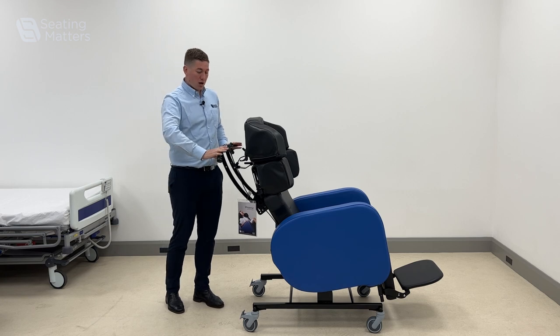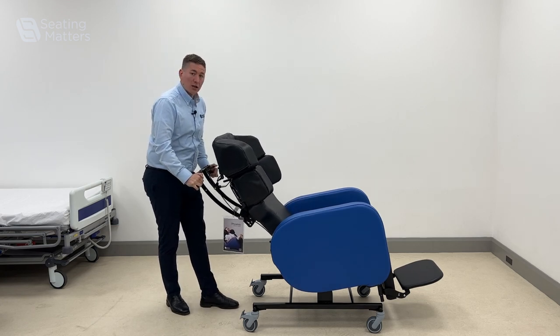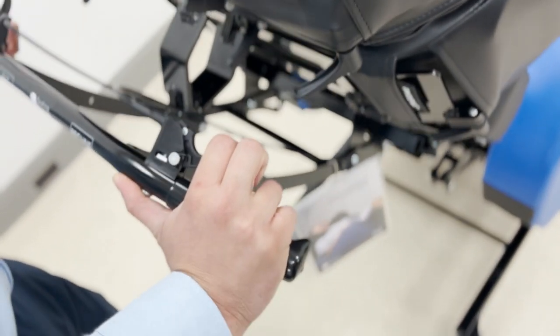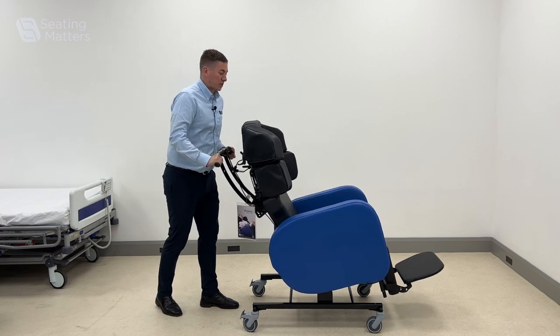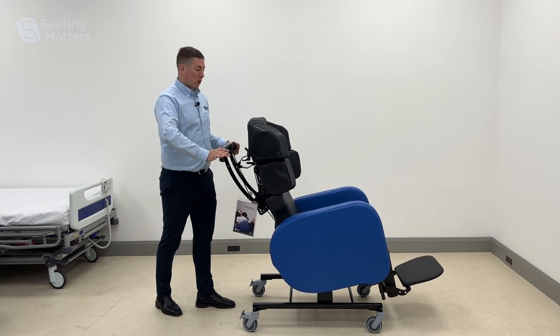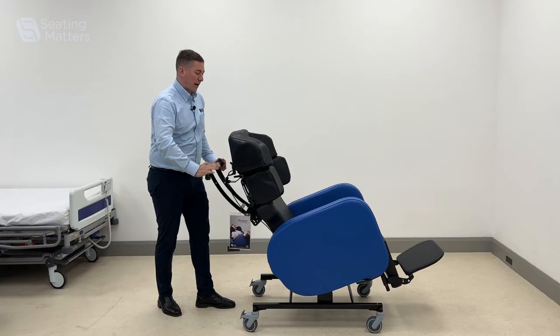Two levers on the back here allow us to open the back angle, so we can change the angle of the back to suit the patient's hips. The lever on the left is for the tilt-in-space, which is very important for pressure redistribution, but also in the Phoenix it allows us to tilt the person back.